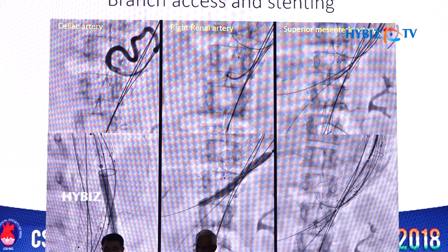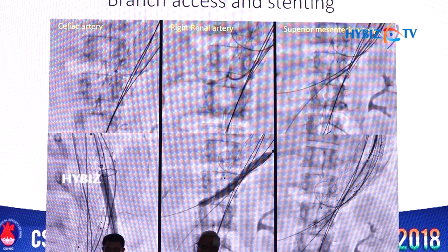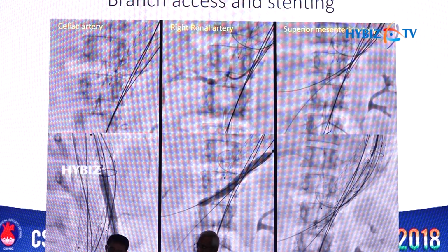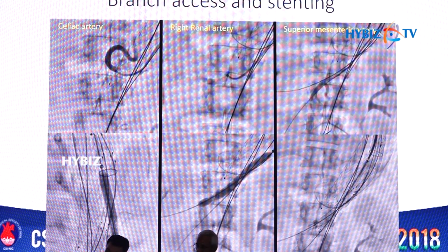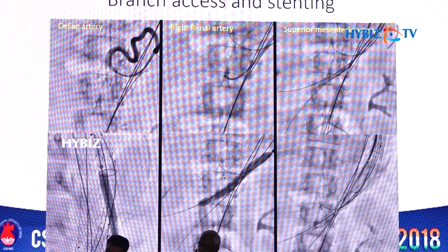An important parameter is all 3 branch stents are proximally led till the flow divider of the bifurcated device. That is an important thing that one should ensure, that all of them end at the same level in the flow divider of the bifurcated device.